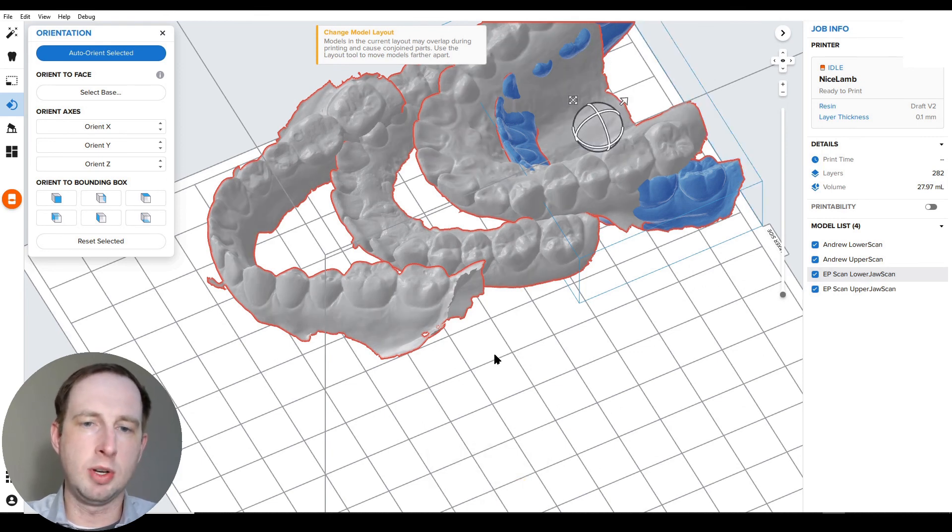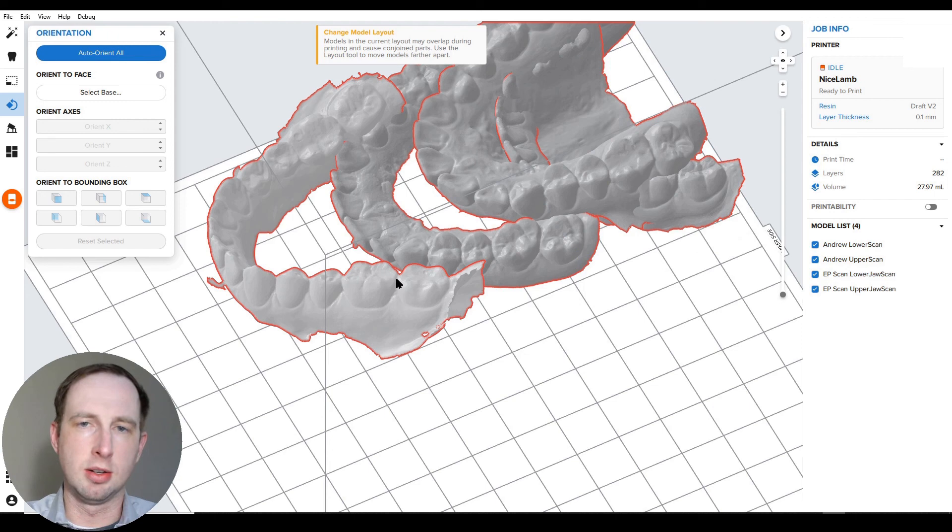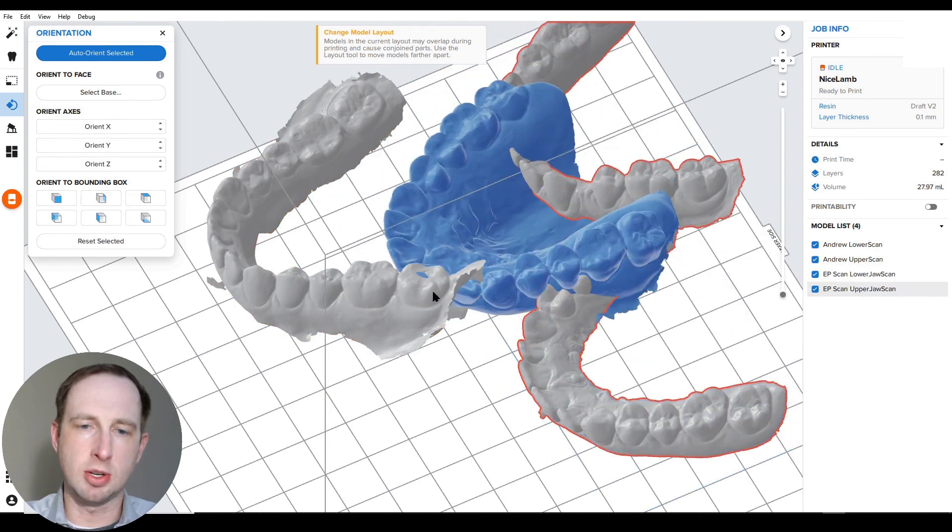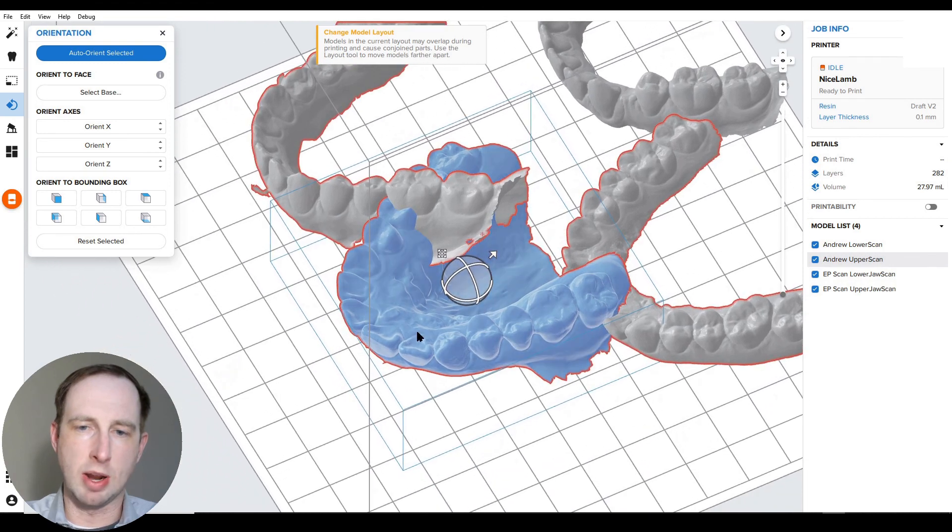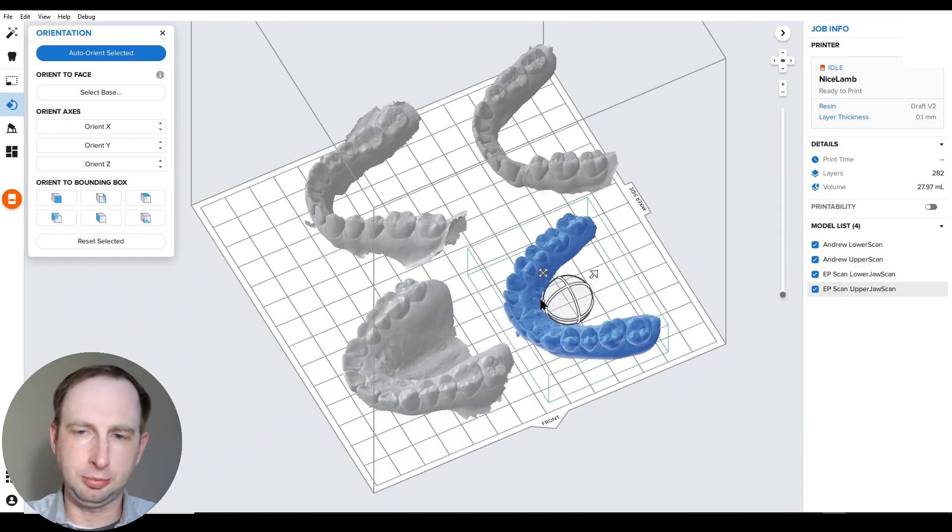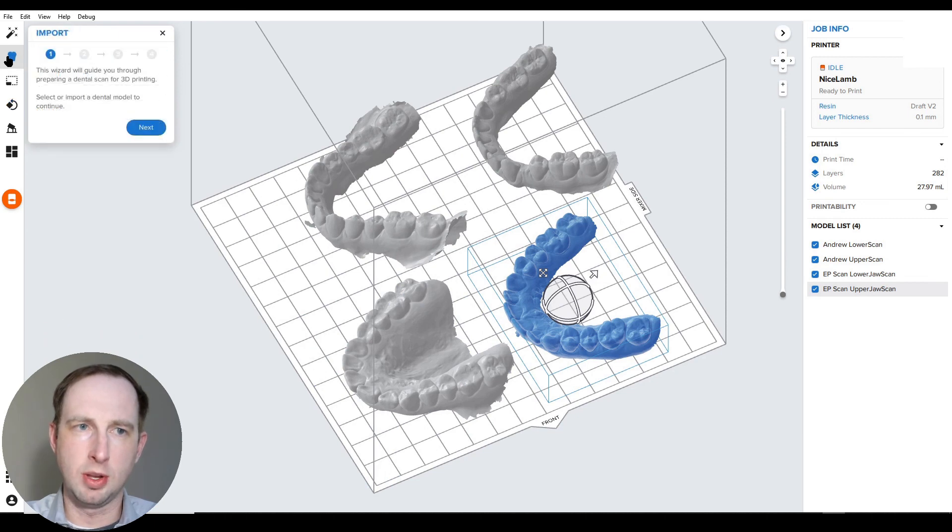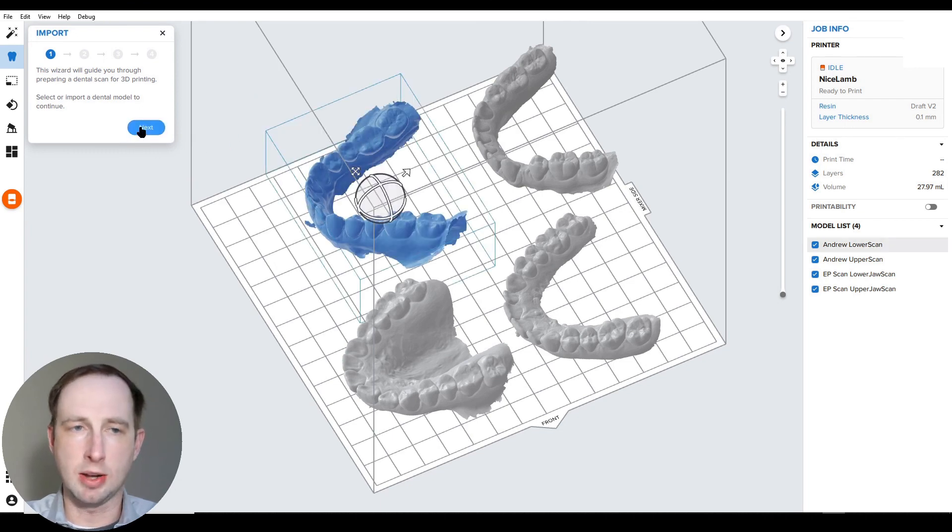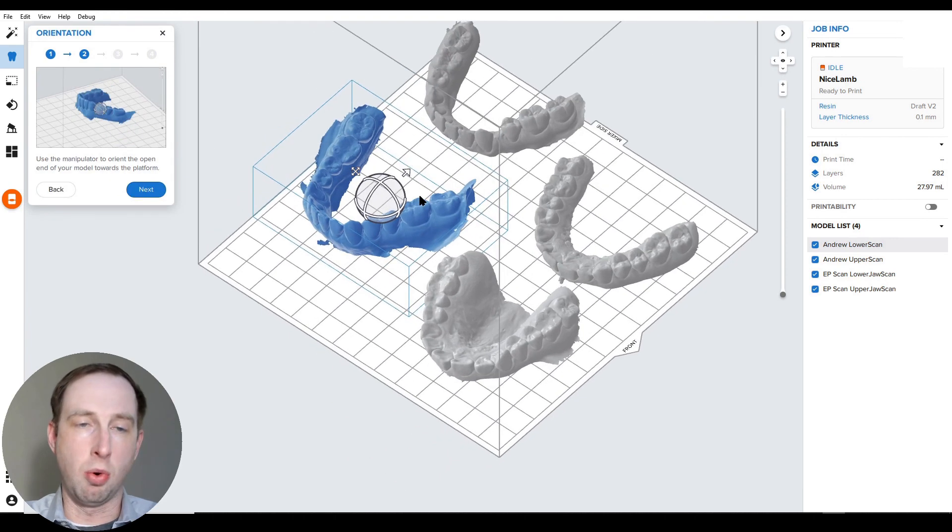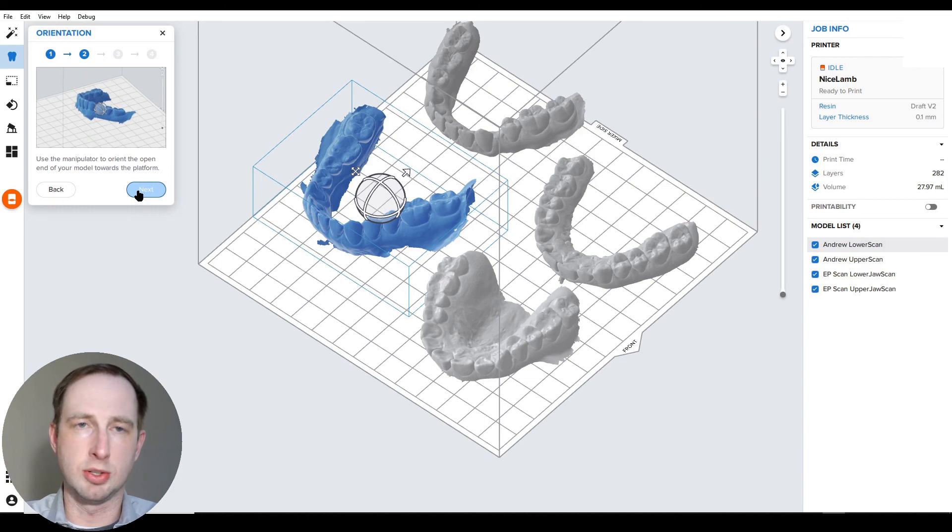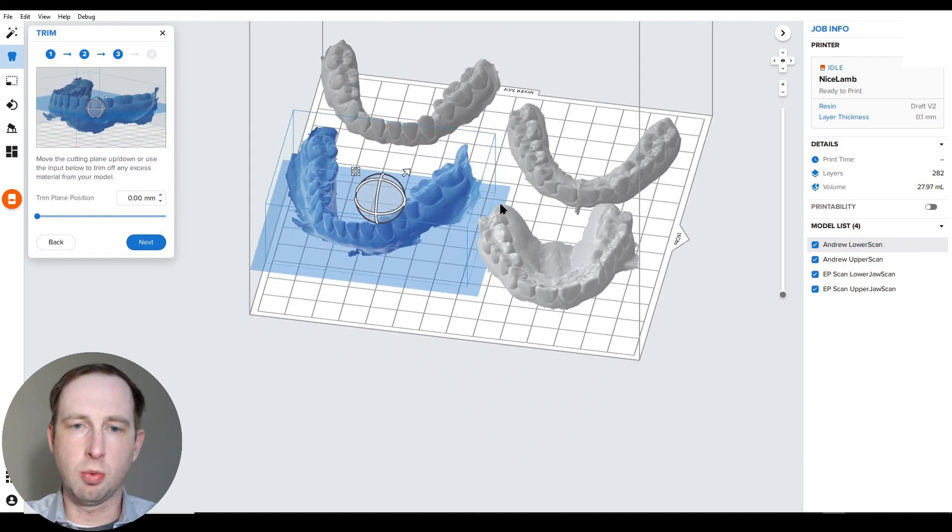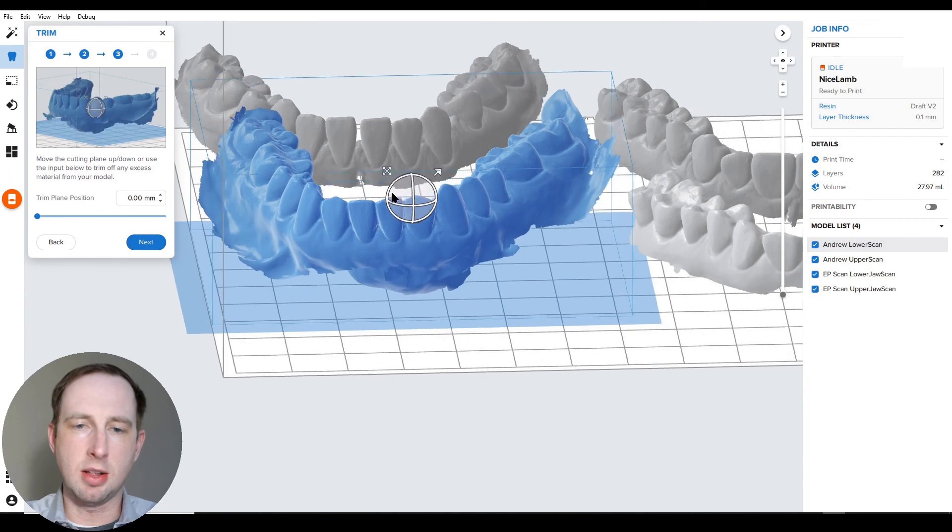Now that they're in the general correct position, I'm going to bring up scan to model. I'll give them a little bit more space so I can see them all individually and I don't have these red boxes around. I'm going to click on our tooth icon like normal. Since we are not importing, the second you click on something, a surface like this, it will allow you to just go next. We've already put the scans and digital impressions into position, so we're just going to hit next again. And we're going to do trim position.